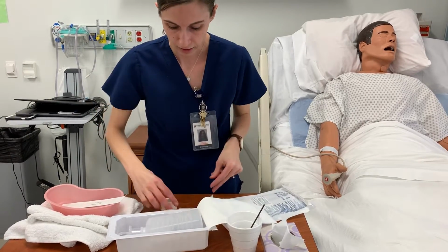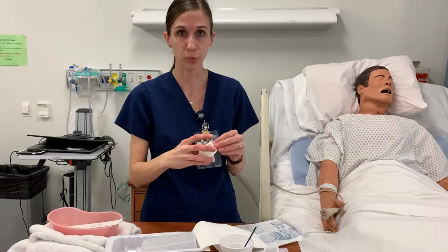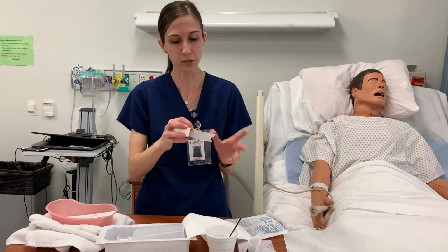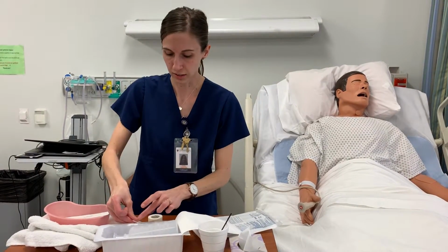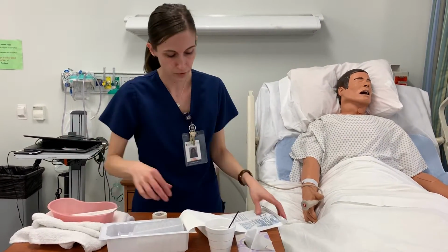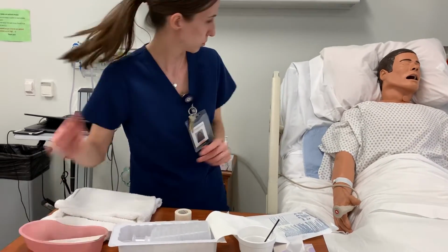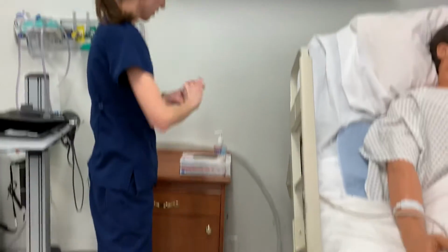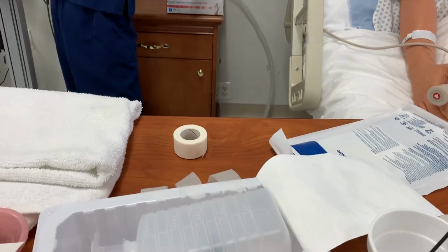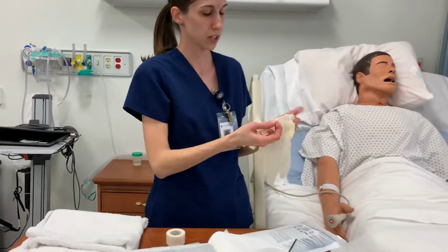And then I will be adding one additional piece of tape so I can mark my NG tube after I've measured it for my client, so I don't need to have it 3 inches, but just enough so I can actually use that as my marker. So at this point I am going to do some hand hygiene one more time. I'm going to put on my gloves. Again, just regular gloves.